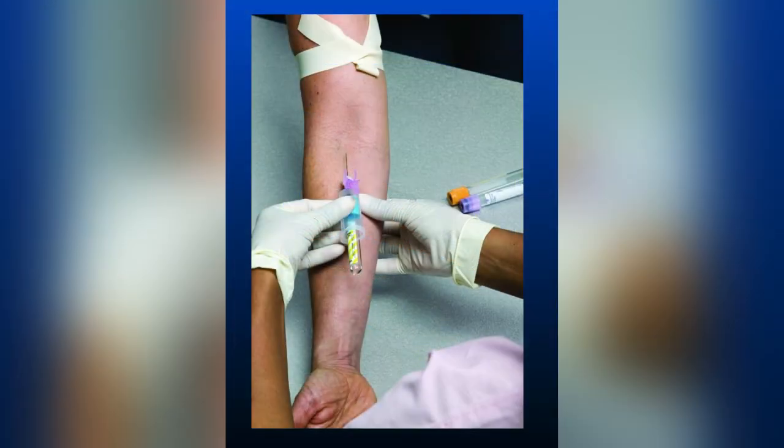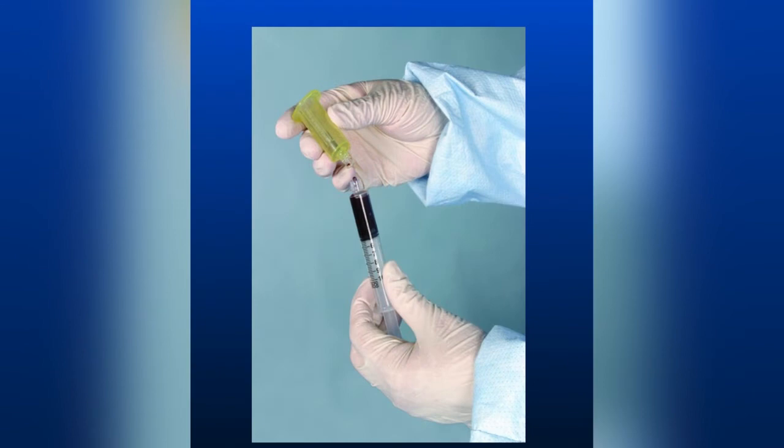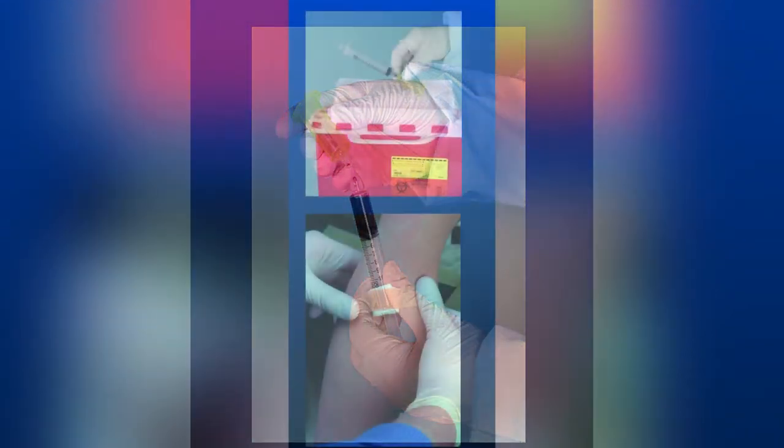Ask patient to remake a fist, anchor vein, and insert needles. Establish blood flow, release tourniquet, ask patient to open fist. Fill, remove, and mix tube in order of draw.